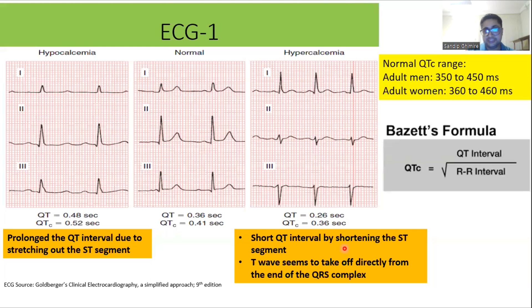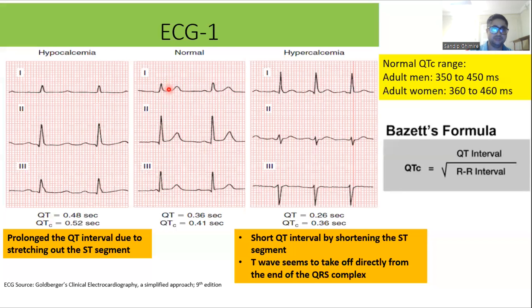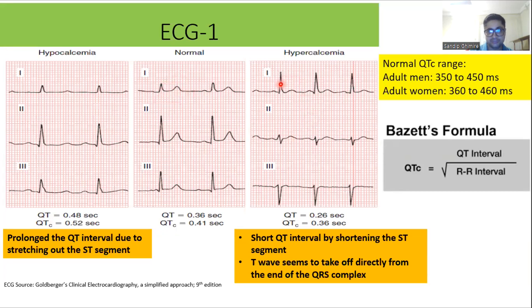Now we'll go through some ECGs in hyper- and hypocalcemia and look at the findings. This first ECG actually shows three ECGs side by side — a normal patient, a patient with hypocalcemia, and a patient with hypercalcemia. Starting with hypercalcemia, you can see that the ST interval is shortened compared to the normal QT.